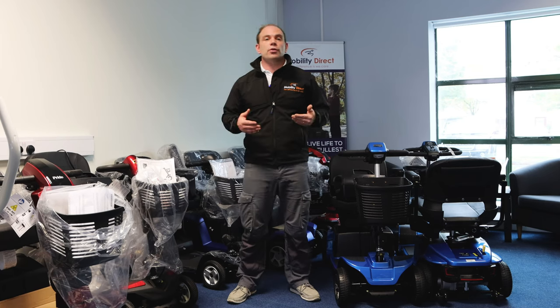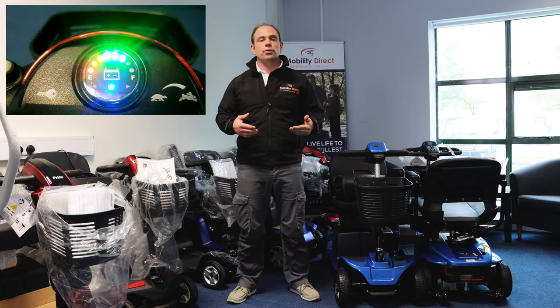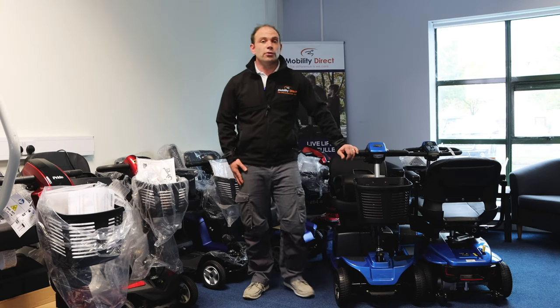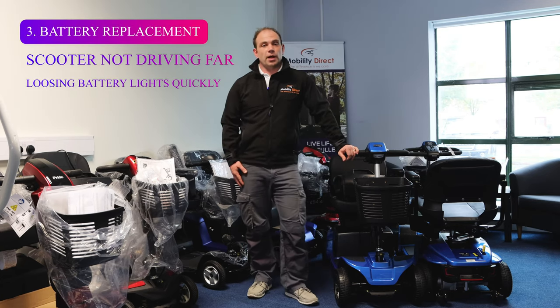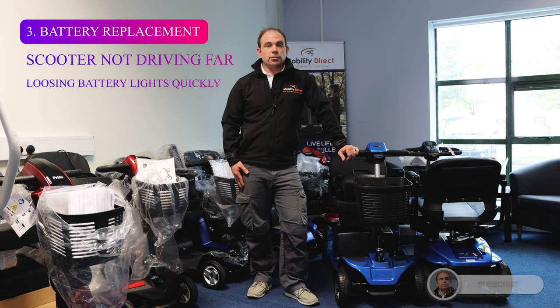Number three: if you notice that your scooter isn't driving as far as it usually does, the battery lights are going down quite quickly, or the scooter has been laid up for a number of months, it's very likely that the batteries will have to be replaced. If we supplied the scooter then we can organize the battery replacement, otherwise you need to contact your scooter retailer or a local battery supplier.